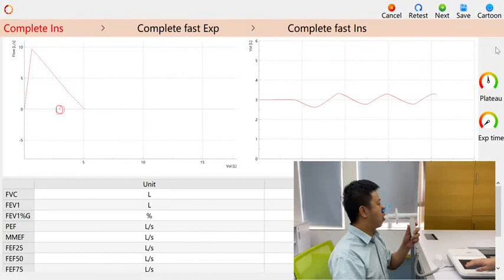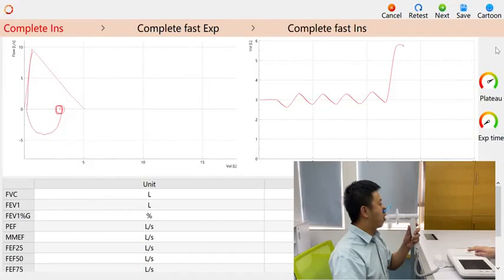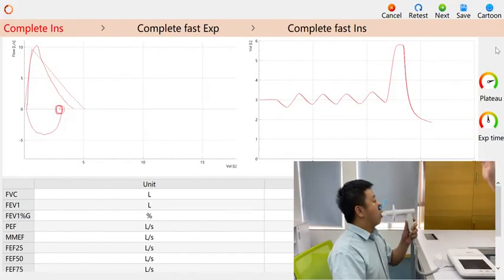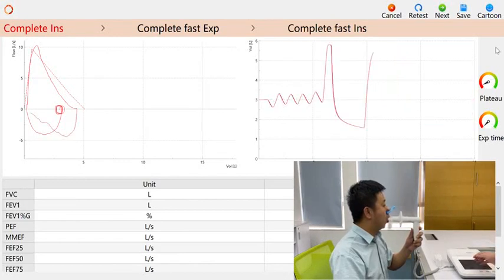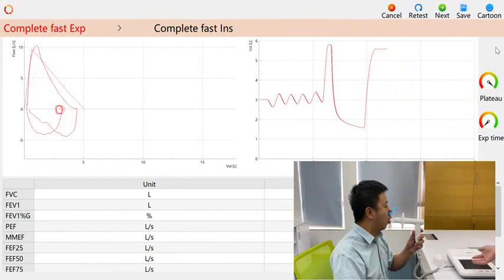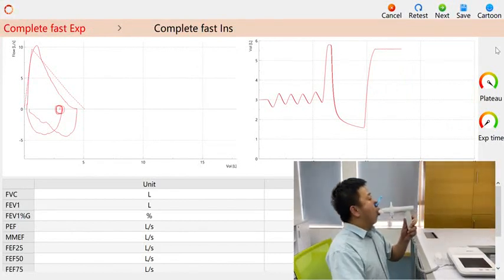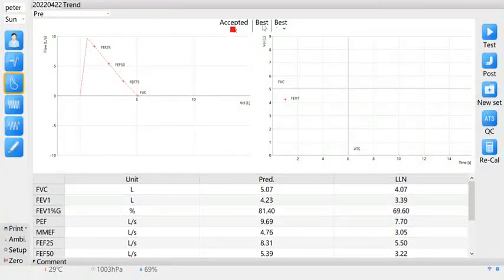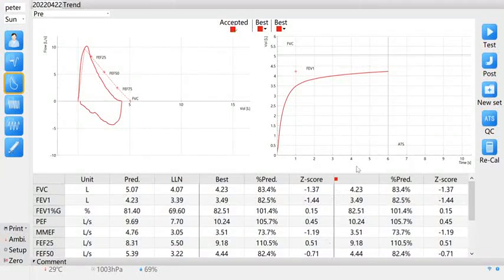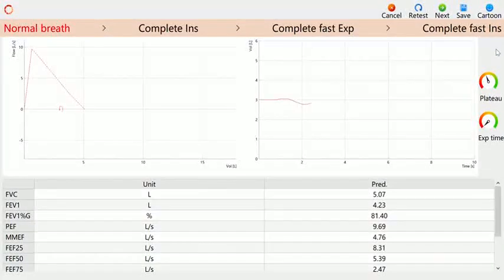Inhale, exhale, inhale, exhale, inhale, exhale, inhale hard, blow hard, keep blowing for 6 seconds. Inhale hard, and the blowing is over. Click Save in the upper right corner to save the test results. During the test, avoid letting the tester blow continuously. The second blow shall be carried out at an interval of 10 to 20 seconds.